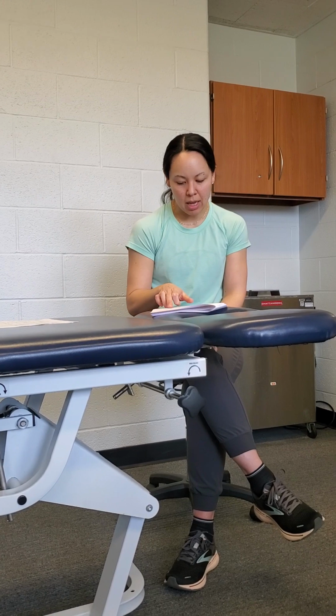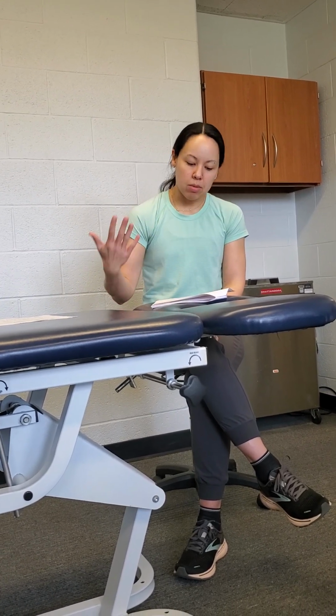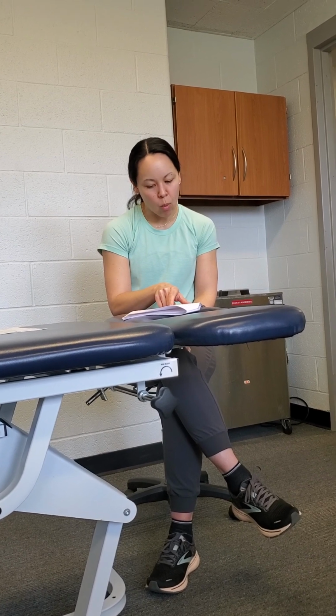As those numbers increase, you still have to inform the patient. You want them to relax for 5 minutes and recheck, and if they're still outside the range, and it's higher than 180 over 110, you're not going to do BFR, and you want to inform them. Also inform the MD. Exercise is contraindicated, correct. So BFR would be too. I guess that's a good way of thinking about it.